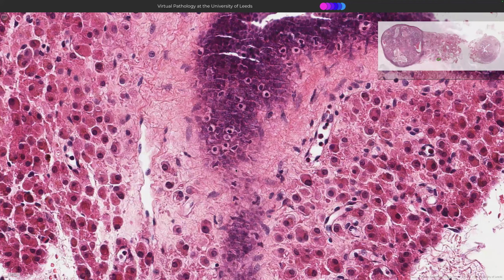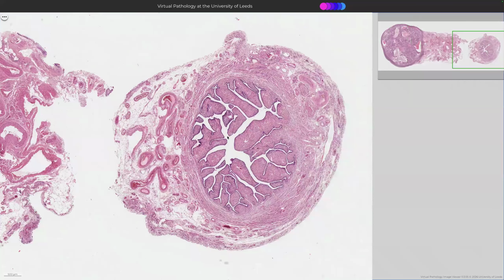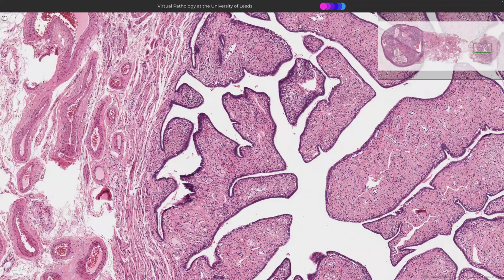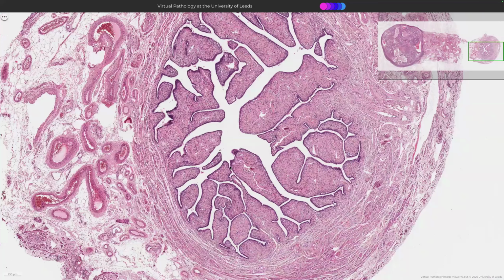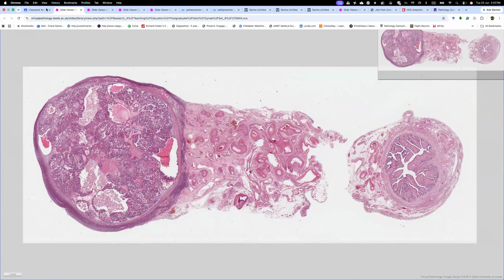Okay, so what else is on this slide? We have a fallopian tube that is also looking slightly postmenopausal. So I usually scroll through these at 4 times, and then I see the purple bits. And here we have some cross-cutting, but we also probably have some secretory hyperplasia. Okay, but that looks pretty normal otherwise. Okay, that was clear cell carcinoma of the ovary. Let's carry on.